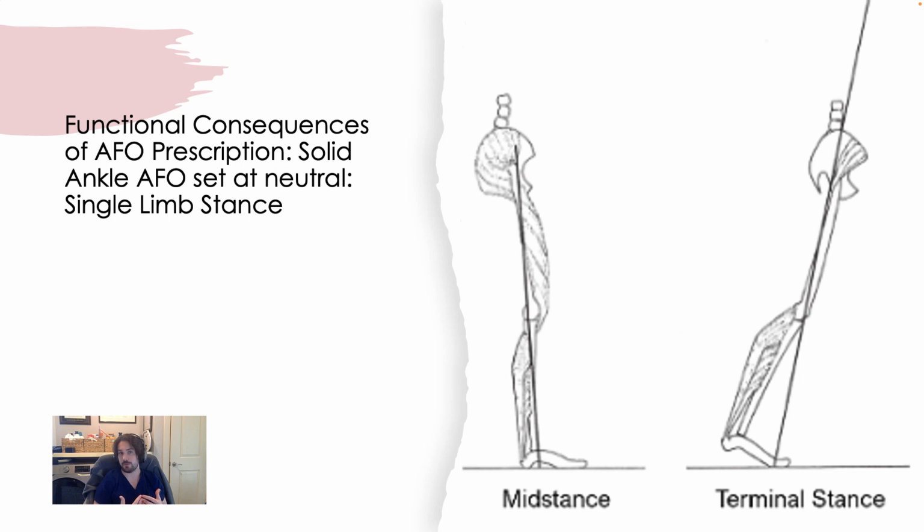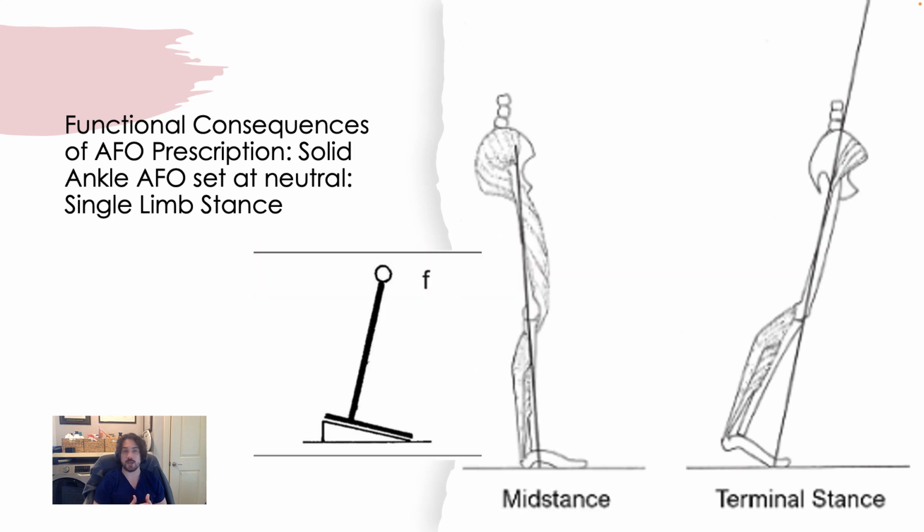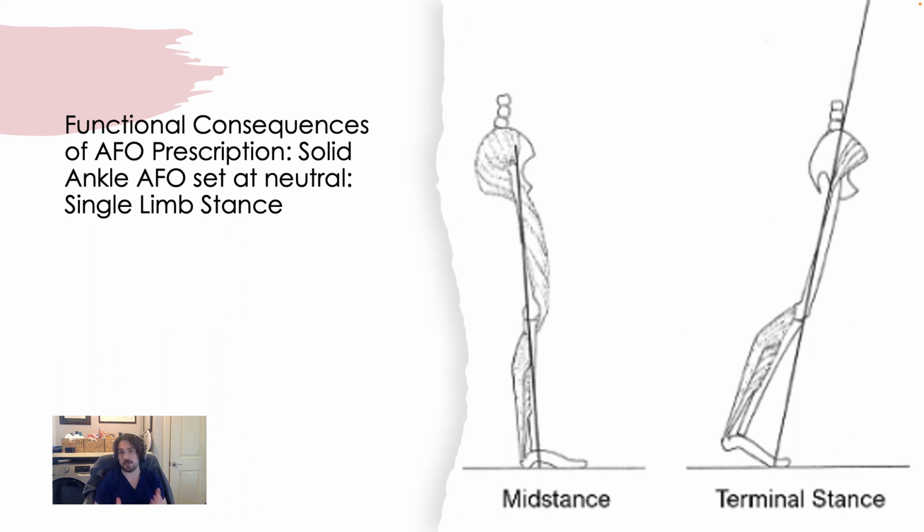If we feel that we're sacrificing too much gait efficiency for that stability, a decision we might make if we're seeing a lot of knee hyperextension, then we can choose to wedge our patient to move their shank into more of an optimal 10 to 12 degrees of incline. That promotes more of a flexion moment at the knee. And so you might have to tweak this a little bit to get your optimal interplay between enough stability to be safe and enough mobility to be efficient.